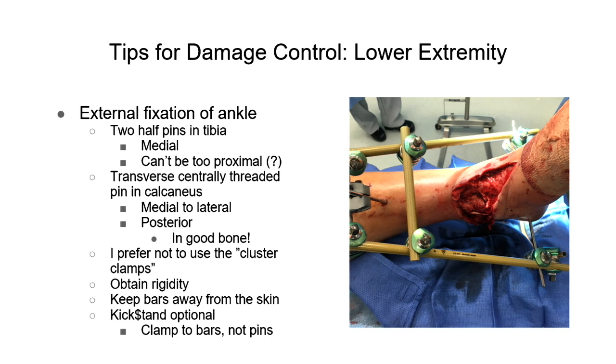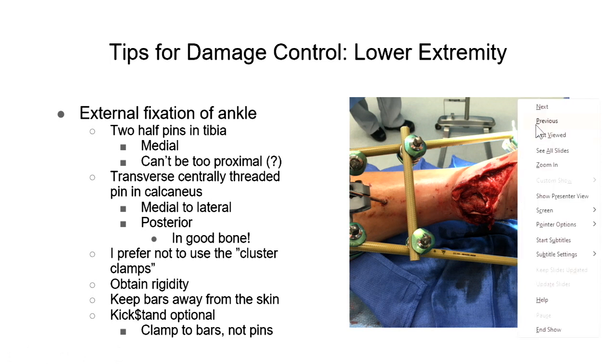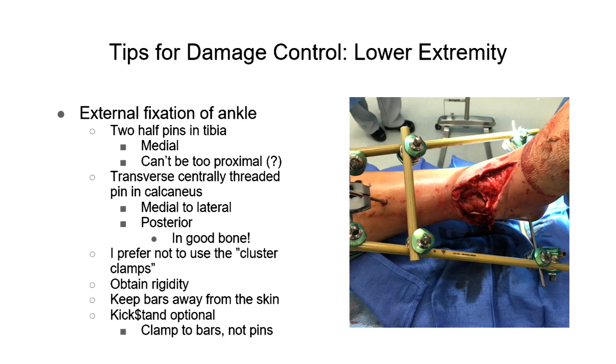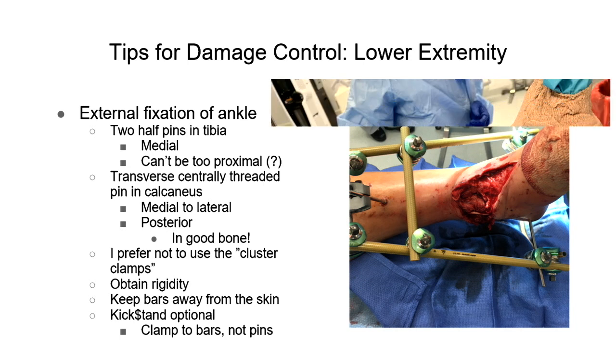Here's your kickstand with the dollar sign. This is just an example. What I mean about a kickstand is here. This keeps it off the bed. This person came in with a kickstand, if you guys are into that kind of stuff. Put your kickstands bar to bar, not pin to bar, because then the little clamps will rotate around the skinny pins. You put them bar to bar, there's less for them to rotate around. That's what's going on here, is that they're actually bar to bar.